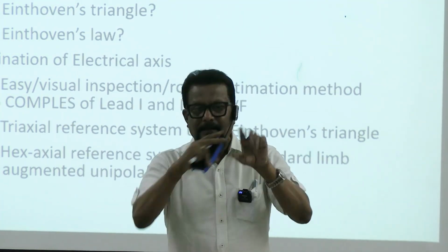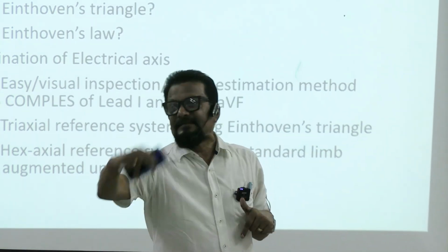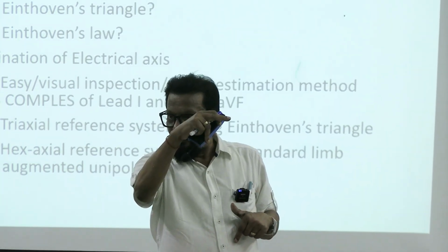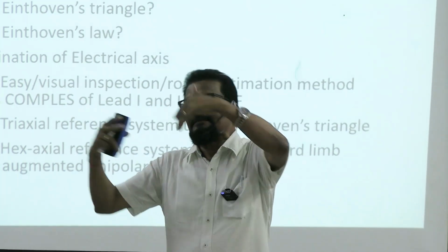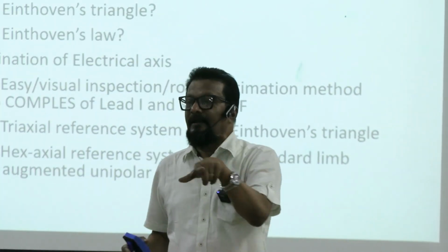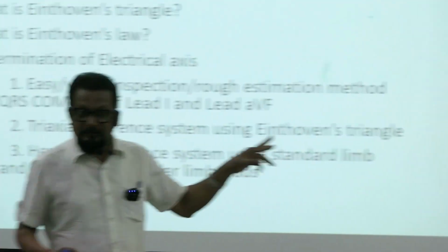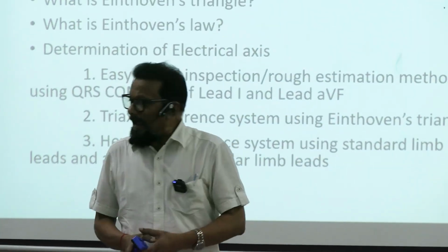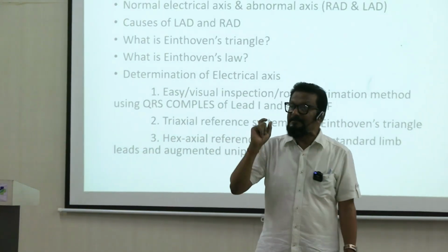At a particular moment, a particular area is depolarized, but in the next moment the area is increased, and in the next moment the area is decreased. As it is, the potential is gradually changing. It is not fixed, and because of that we get different waves. Sometimes it is the P wave. And these vectors, I told you about the dipole. Dipoles actually generate a vector. The one term I uttered, this is vector.